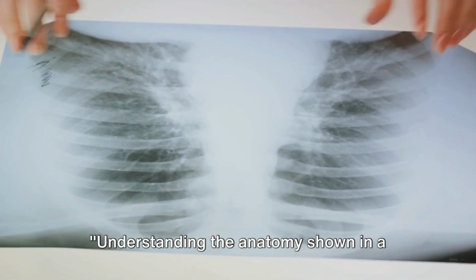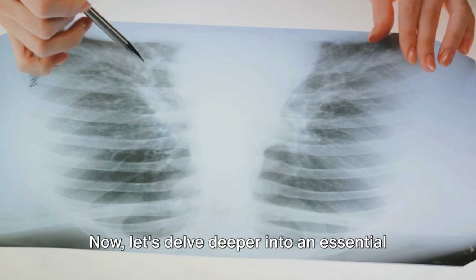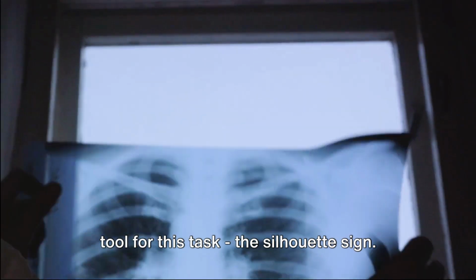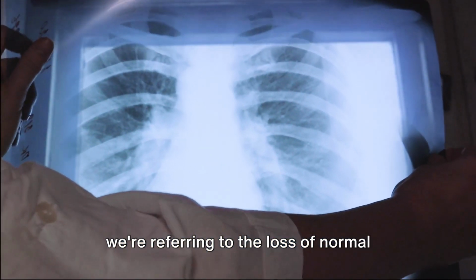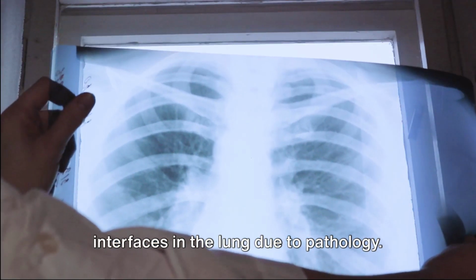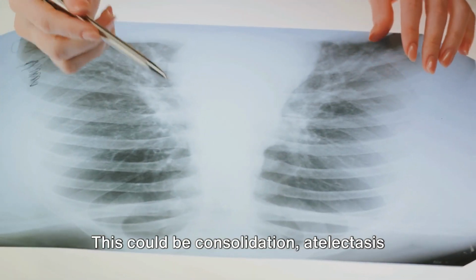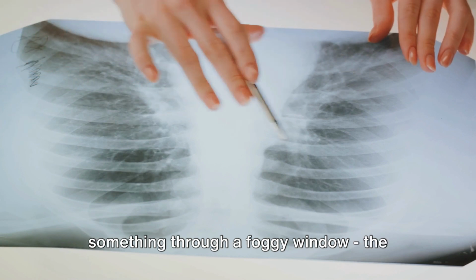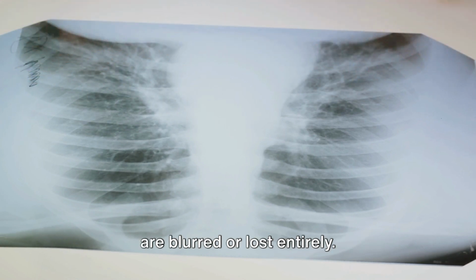Understanding the anatomy shown in a chest X-ray is vital for localizing lesions. Now, let's delve deeper into an essential tool for this task: the silhouette sign. When we talk about the silhouette sign, we're referring to the loss of normal interfaces in the lung due to pathology. This could be consolidation, atelectasis, or even a mass. It's like when you're trying to view something through a foggy window. The clear lines and forms you typically see are blurred or lost entirely.